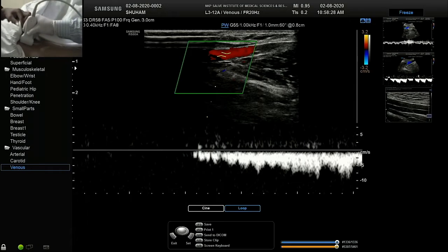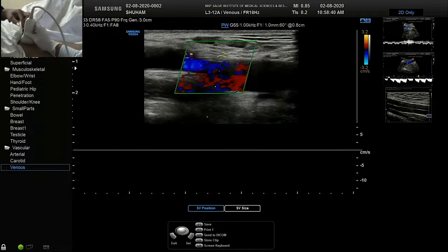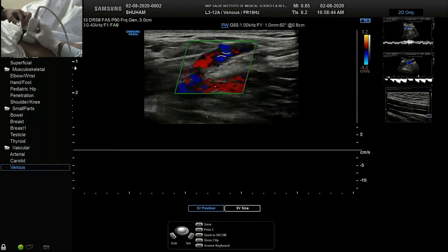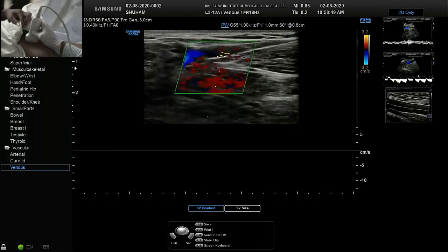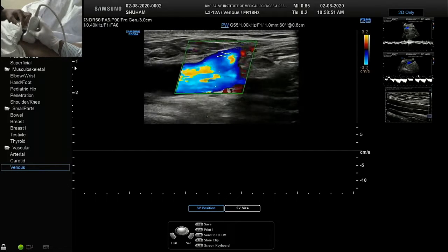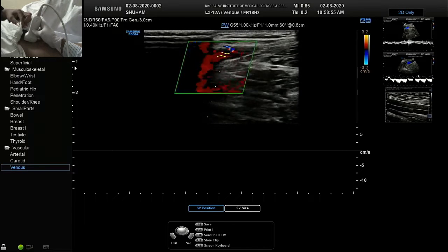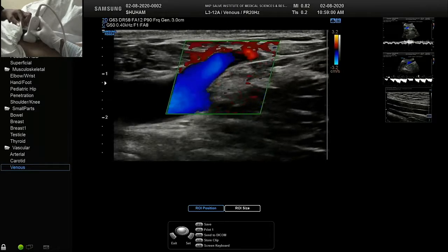So this way 5-6 things you have to do. Most important is what you can do additionally is, if your hand is getting stressed, just rest your wrist here and then do the maneuvering. It becomes easy. See, we'll do it again. Remove the spectrum as of now.